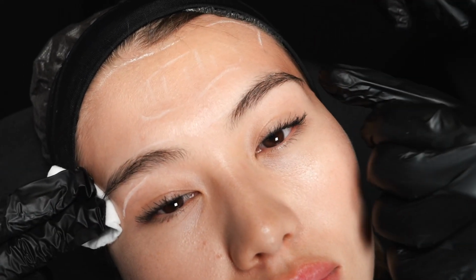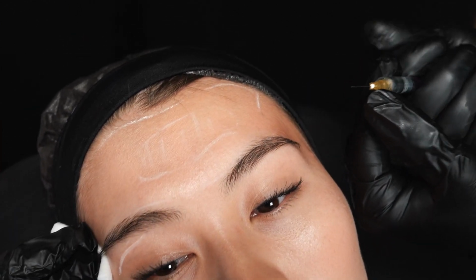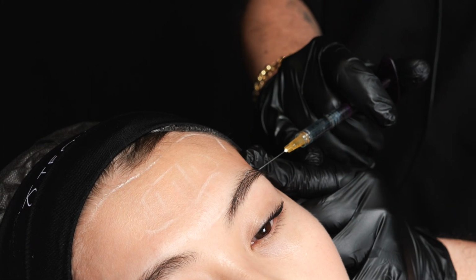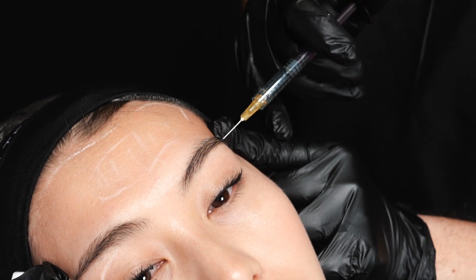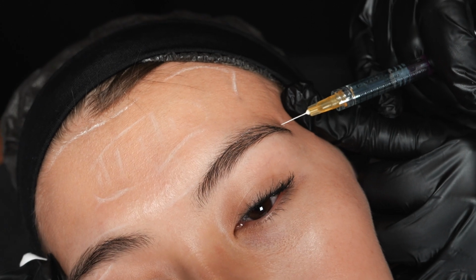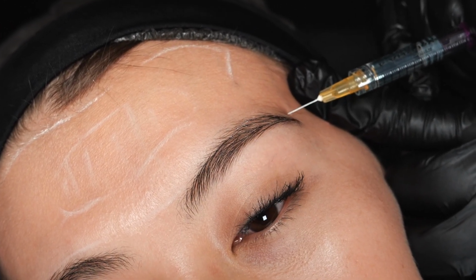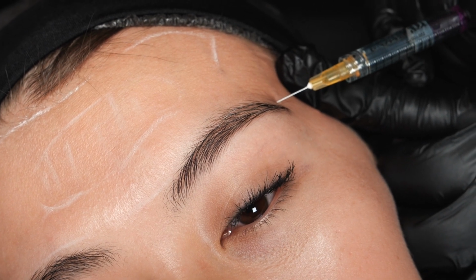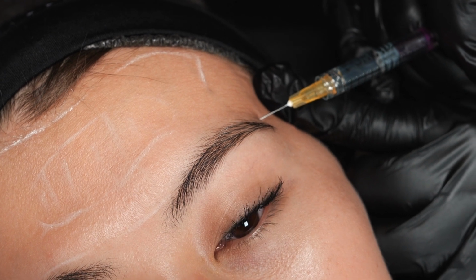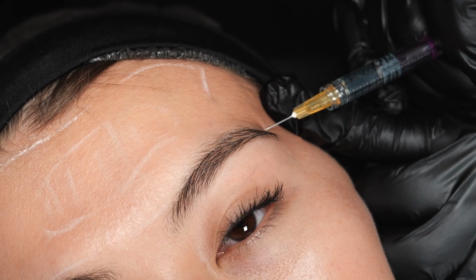Оксан, все чисто, все понятно. Вы хотите задать какие-то вопросы, но опять-таки я проверяю иглу, проворачиваю к себе. Да, мы видим результат потрясающий. Спасибо большое. Итак, зашел на надкостницу. И что я сейчас не так сделал? Я вам скажу. Вы видите скорость введения препарата. Я сейчас сделал что-то не так. Я вам сейчас скажу, что я сделал не так.